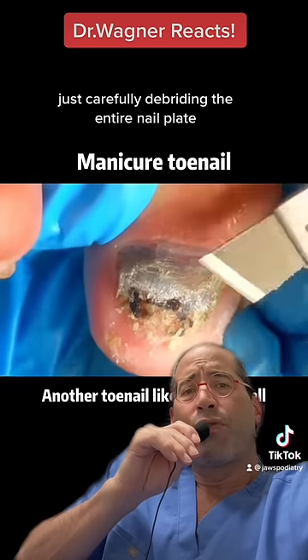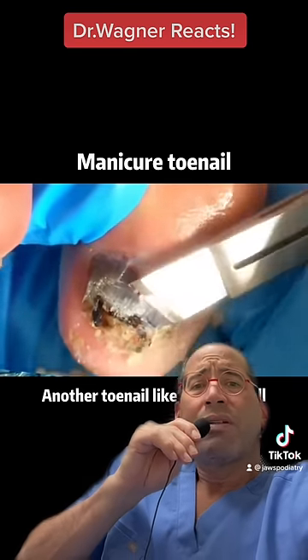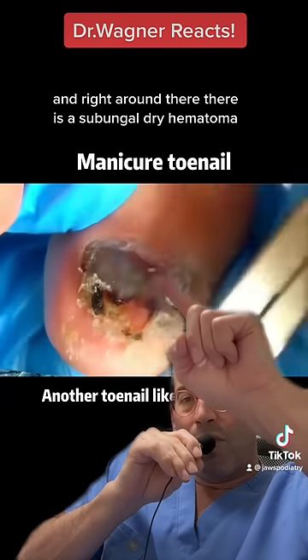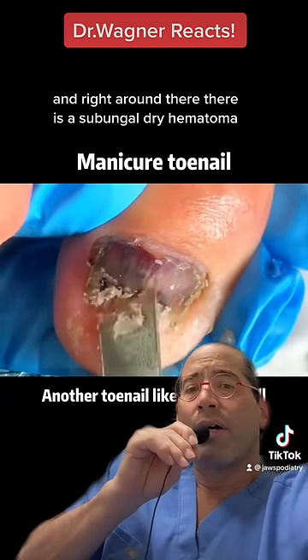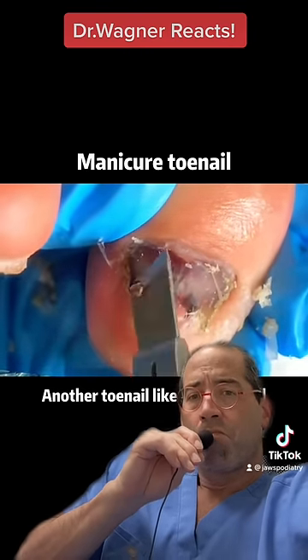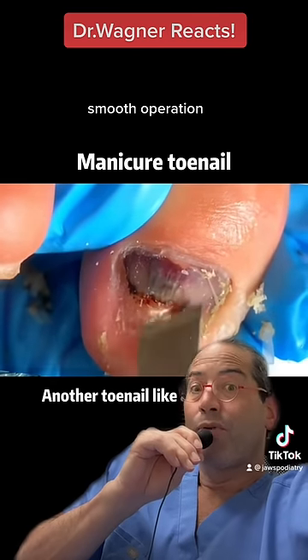Just carefully debriding the entire nail plate — very smooth technique. Right around there, there's a subungual dry hematoma, most likely secondary to trauma. Very nicely done. Smooth operation.